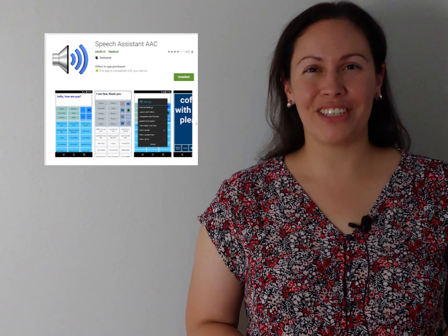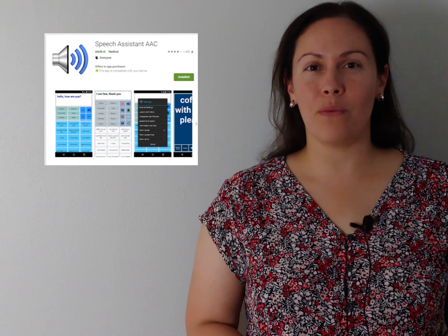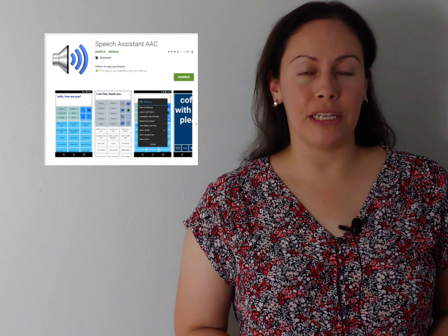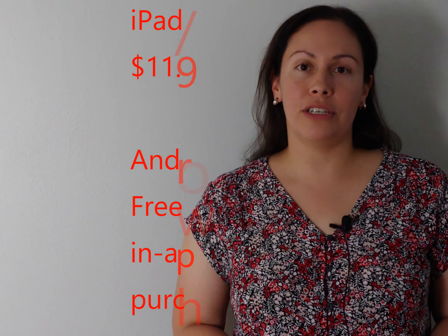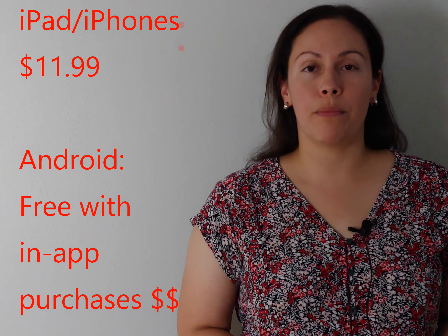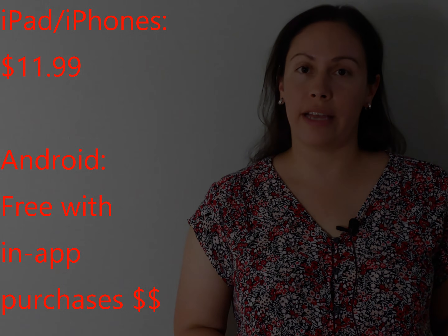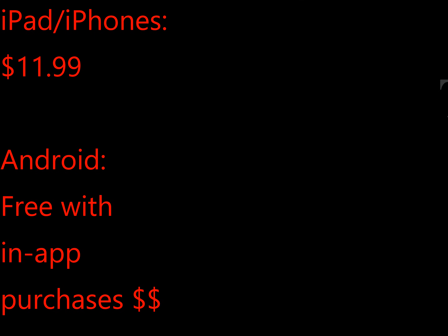As an alternative communication method, I want to demo an app called Speech Assistant AAC, which is available on both Apple mobile devices as well as Android-based devices.